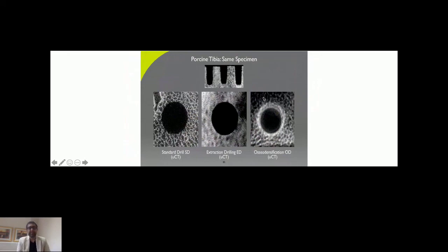This is a patient we did, and good old internal sinus lift or Summers approach is there as well. There is no question to its predictability. This is a patient which the number 6 has to be replaced. So you can see it's got a 0.5 centimeter of bone present. We did the osteotomy, checked the floor of the sinus. Here I'm checking the floor of the sinus is still intact.